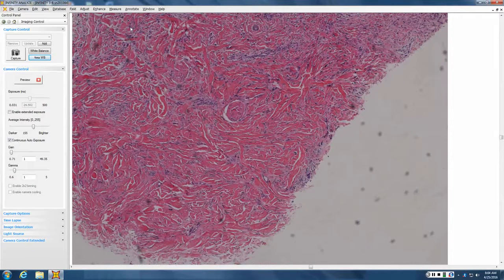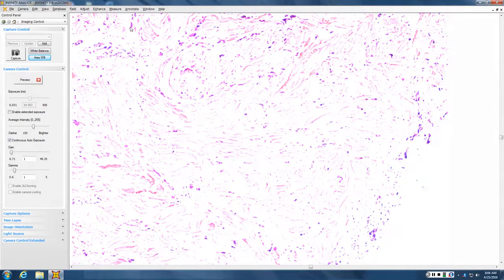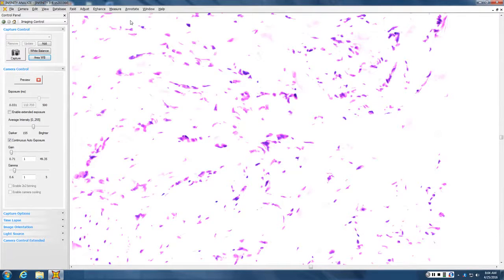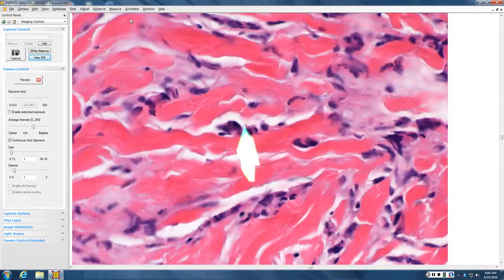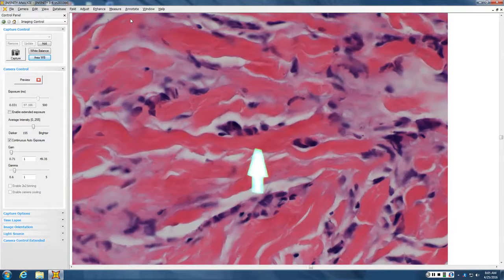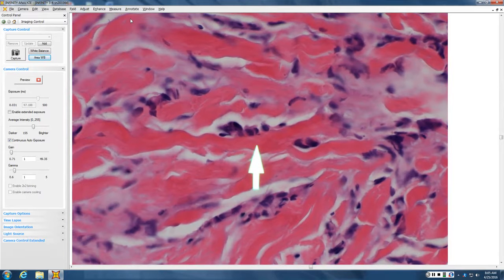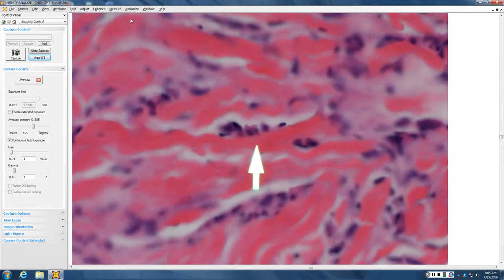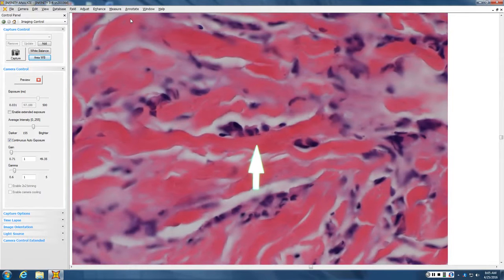Looks like just a busy dermis, right? Almost like a dermatofibroma, but this would be the evil dermatofibroma. And when you look at the cells in the dermis, you can see hyperchromasia and very prominent nuclear molding. Instead of being round, they turn into squares and rectangles because there is nuclear molding where they're adjacent to one another.